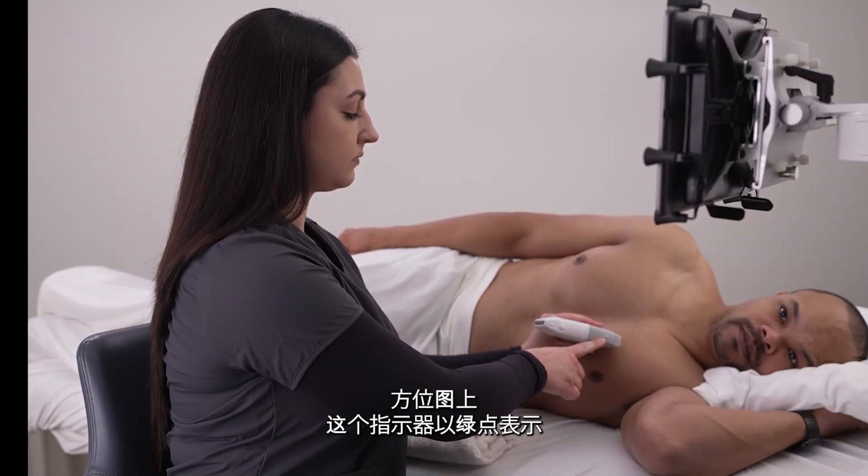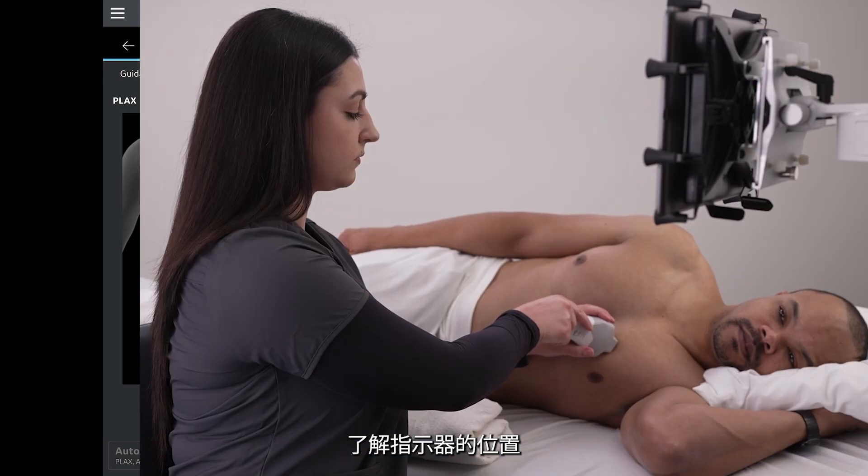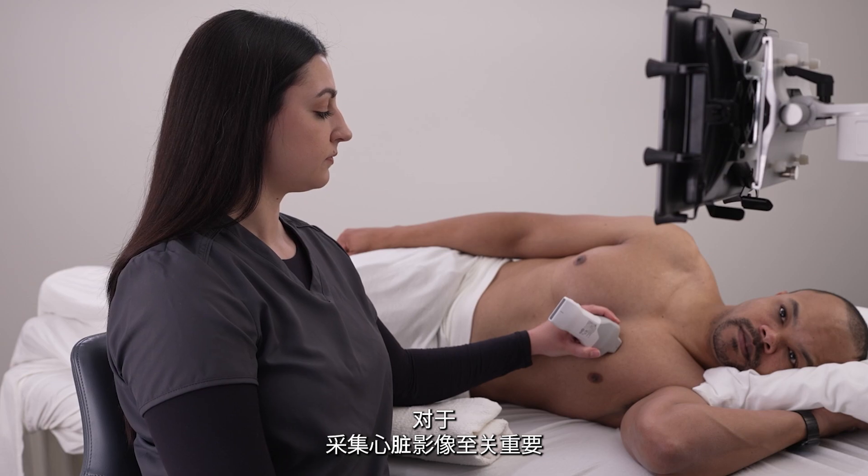Locate the indicator on your probe. This is indicated by the green dot on the orientation diagram. Knowing where the indicator is is critical to capturing images of the heart.